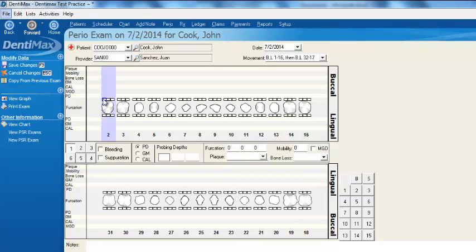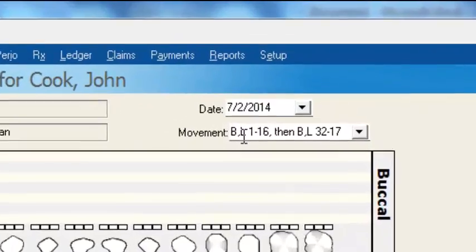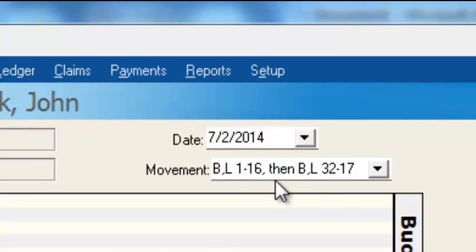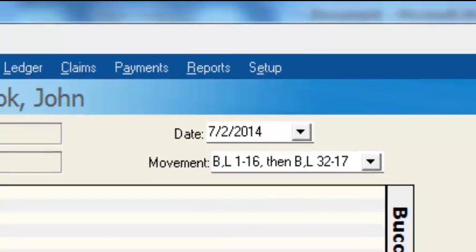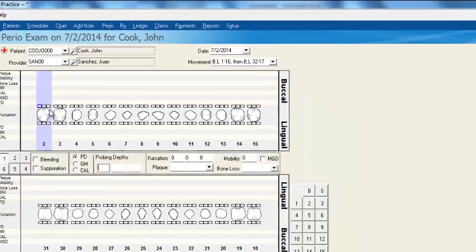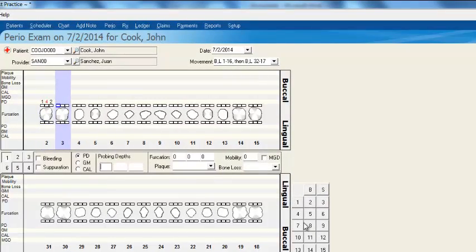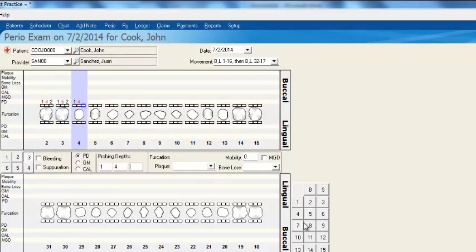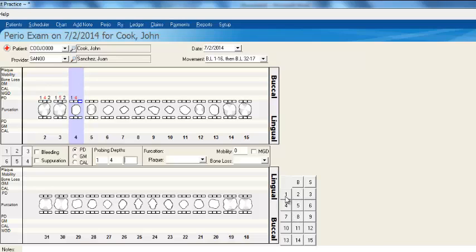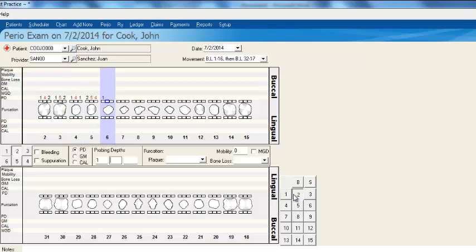There are several movement options you can choose for entering your perio measurements. You can do the buccal and lingual side of teeth 1 through 16 first, then go down to buccal and lingual for 32 through 17. With this movement selected, you can use your keyboard or the keypad in the bottom right-hand corner to enter the measurements.